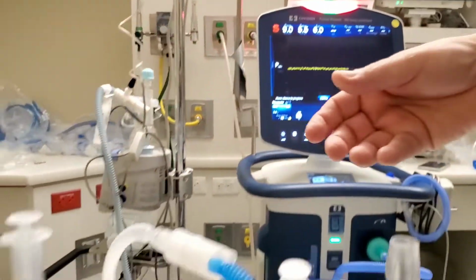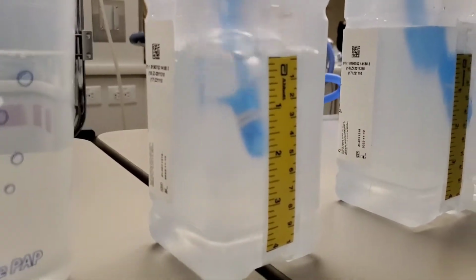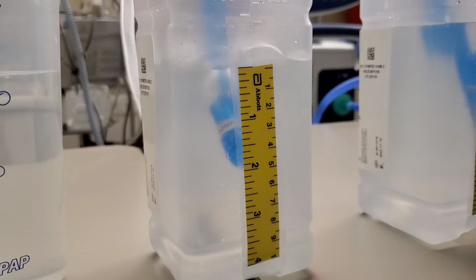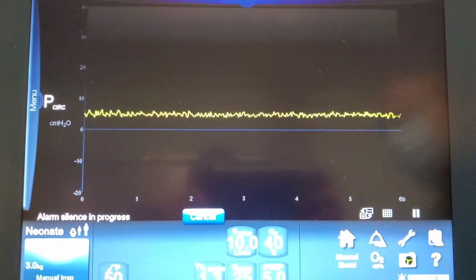And then this one over here has a little bit of a different curve to the end of it. I don't know if you can see that. And then we'll look at the fluctuation there. So there's a lot bigger fluctuation on that particular one.